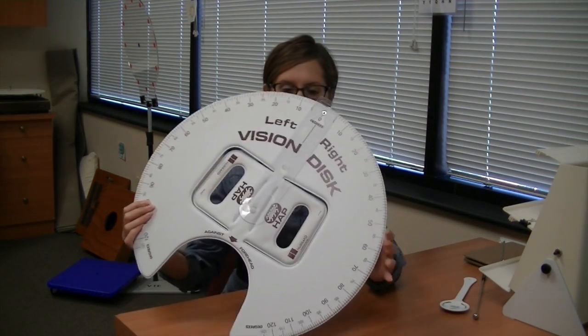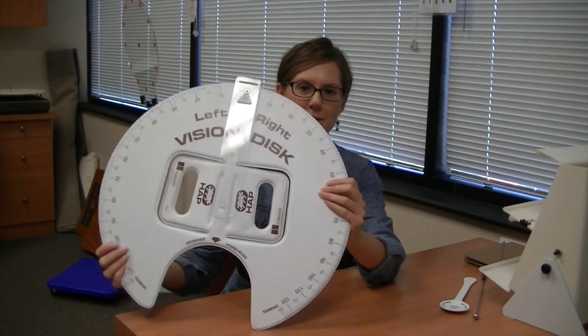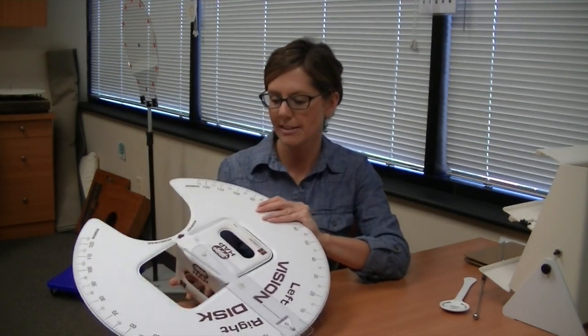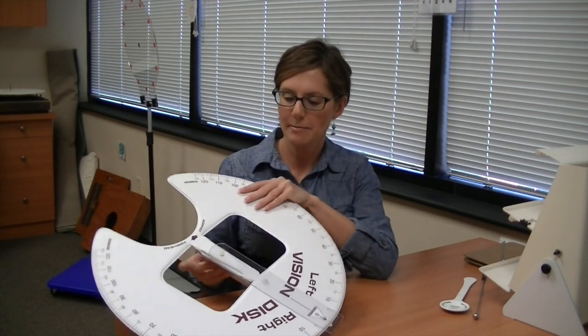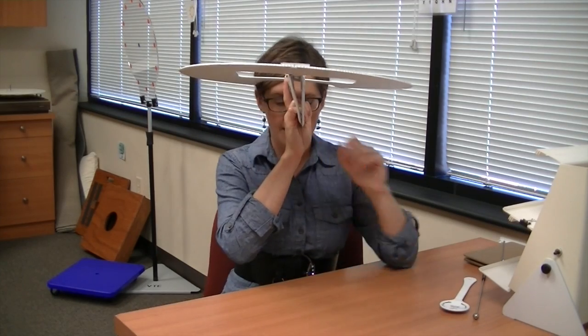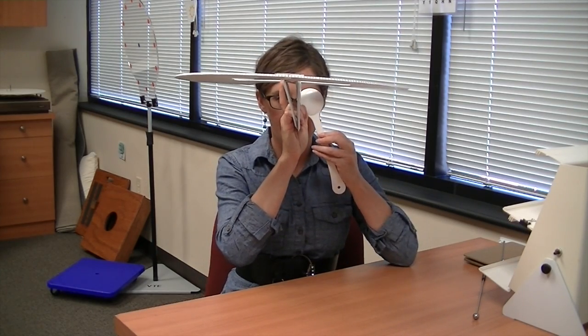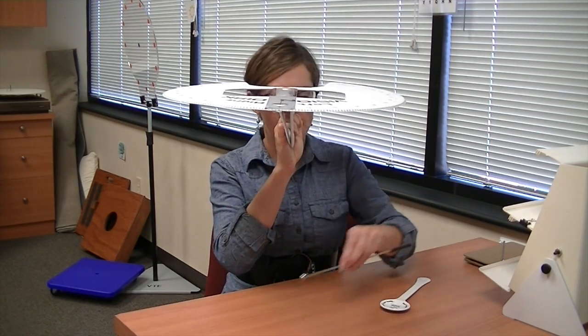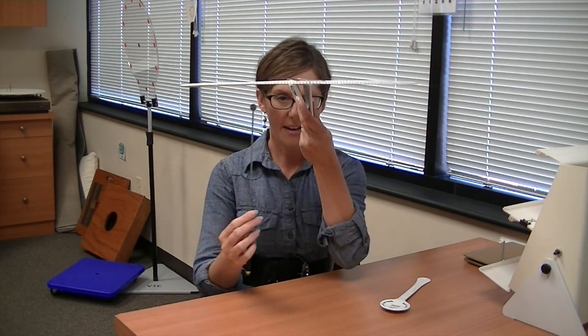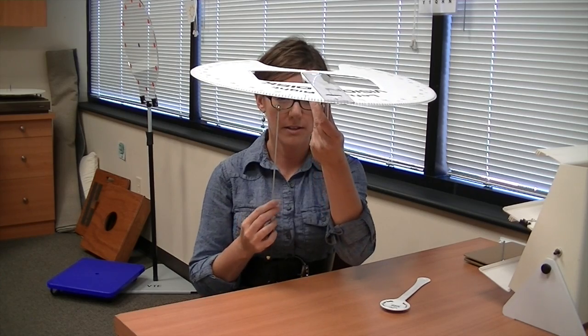This is called a vision disc. It's kind of a goofy looking device — I always tell the kids it looks like the Starship Enterprise. What we do with this is put it in front of their heads. They have one eye covered, and then we use this little handy wand to have them tell us when they feel like this ball is directly in front of their line of sight.